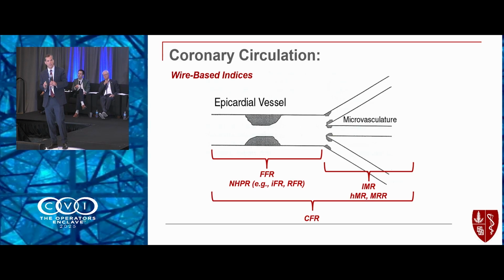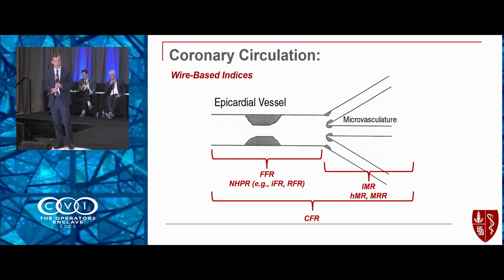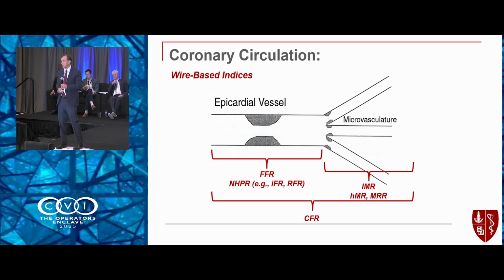CFR is the oldest kid on the block, coronary flow reserve, and it's important to recognize that it actually measures or incorporates the entire coronary tree, both the epicardial vessel and the small vessels. Now, in patients who have quote-unquote normal epicardial vessels, we tend to apply CFR as an assessment of the microvasculature.